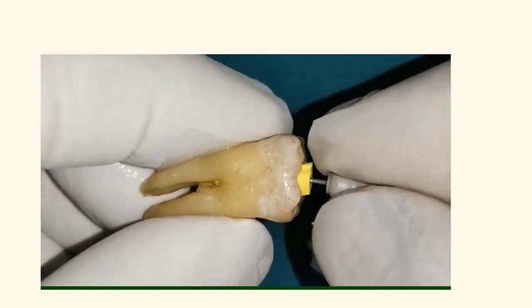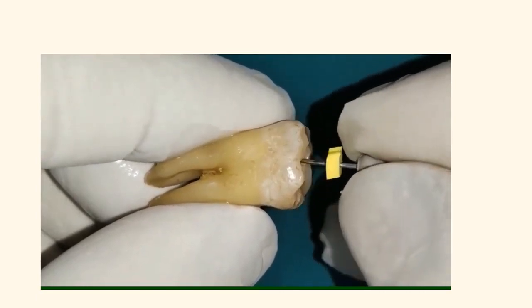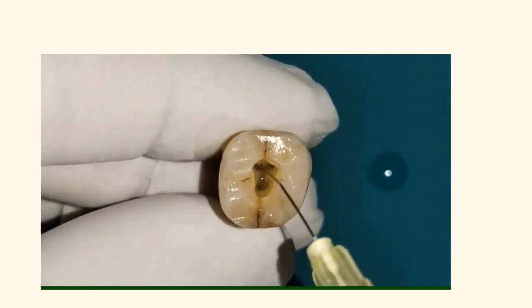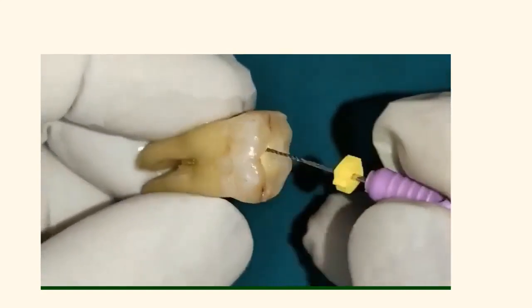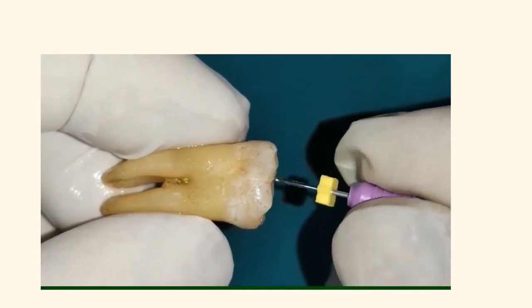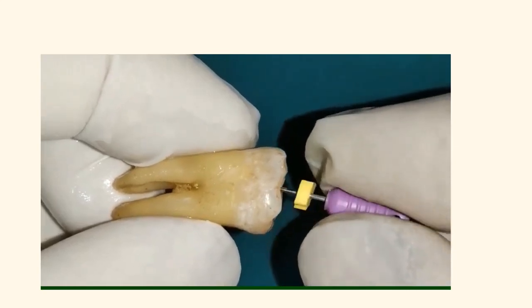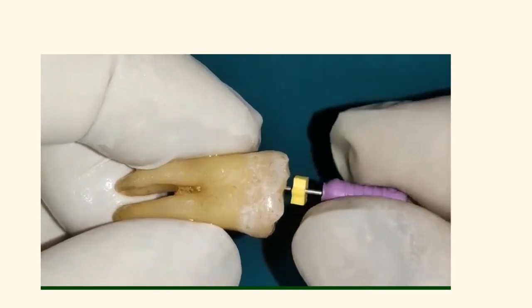Keep an eye on the stopper to check whether the file is progressing apically. Sometimes the file will reach the radiographic terminus easily, sometimes it won't. Once the file reaches the radiographic terminus, remove the file, irrigate the canal and shift to the next file. When you get resistance, don't force the file. Remove it, irrigate the canal, clean the flutes, pre-curve the file again and reinsert it in the canal, slowly advancing apically with watch winding motion.